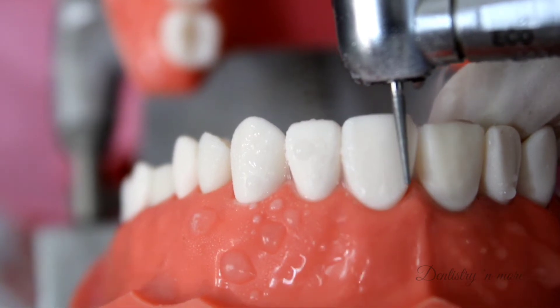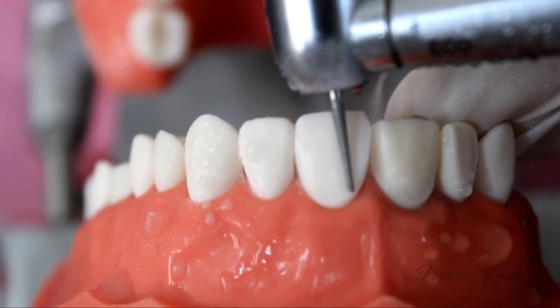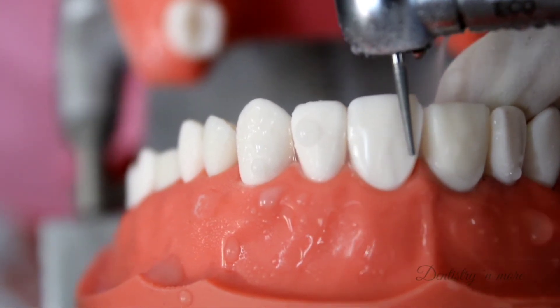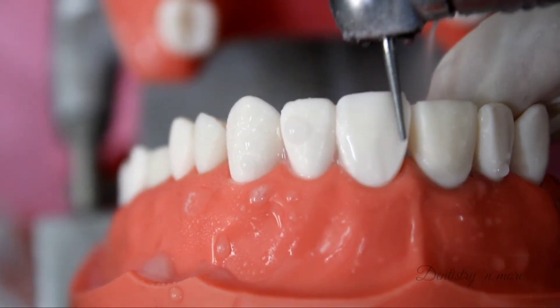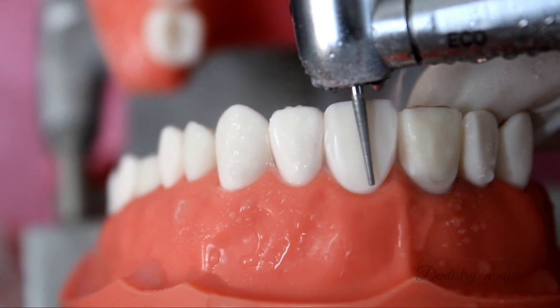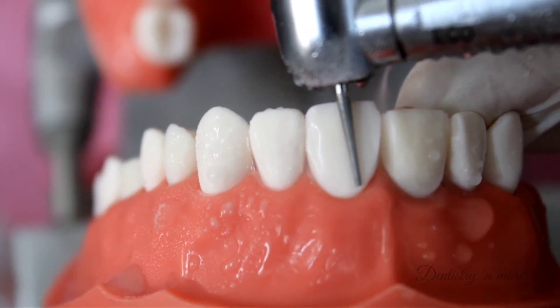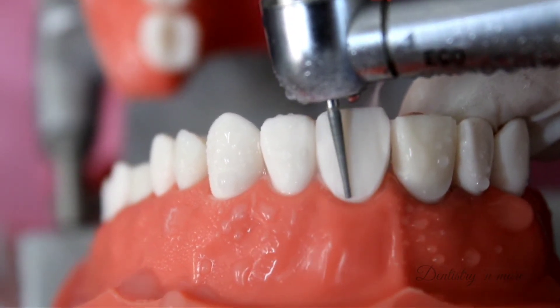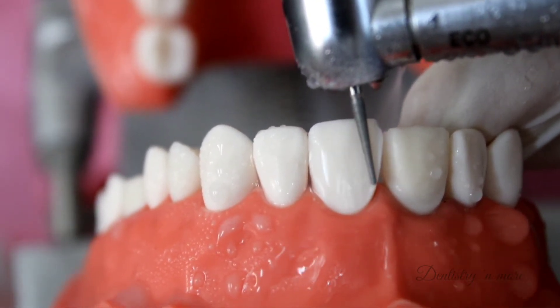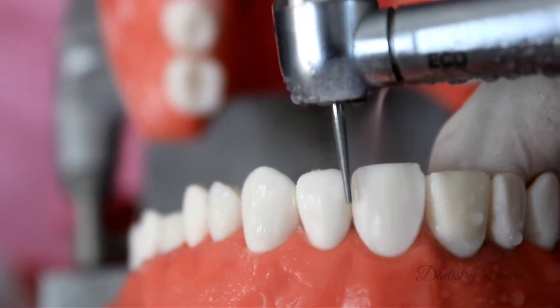The technique I use to determine the amount of reduction is either a putty matrix, a periodontal probe, or the burr itself — although the last technique is not foolproof. While preparing the labial surface we also provide the finish line, which here will be a shoulder finish line of about 1.2 mm at the cervical margin. The burr has to be kept as parallel to the long axis of the tooth as possible — there is no need for bending or angulating the burr in any way.